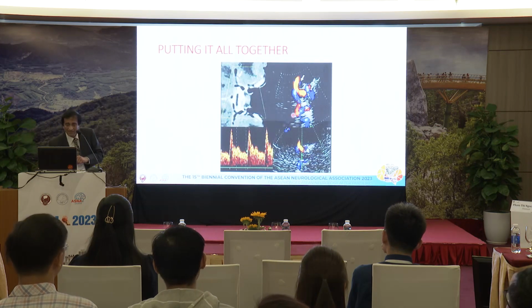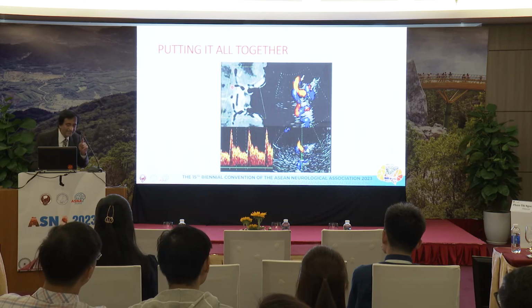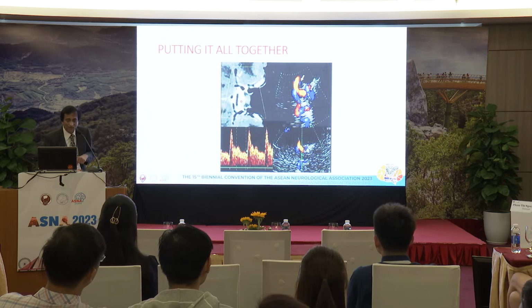Here you see beautifully in this patient on the MRI, MCA coming here, you see that? ACA here, terminal ICA here, and this is the opposite side.